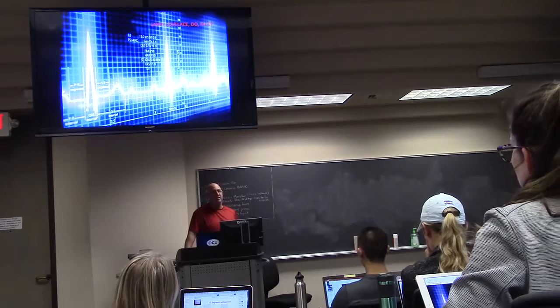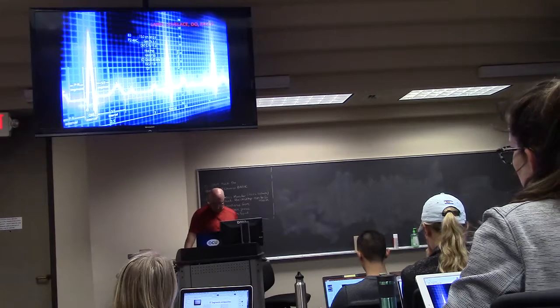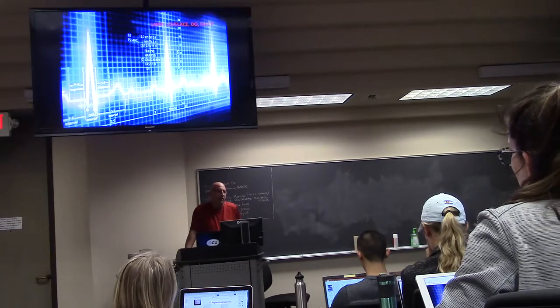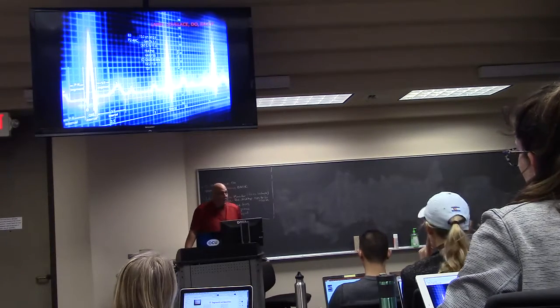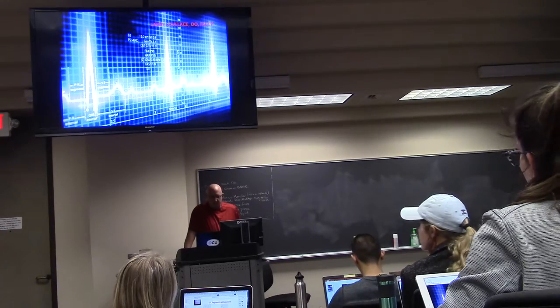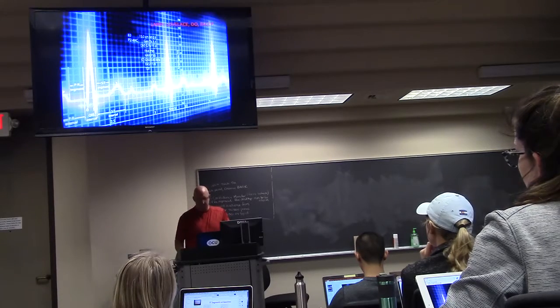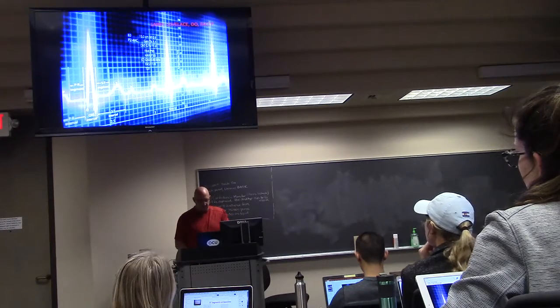So this is a lecture on the deadly EKGs. I know you guys have already had EKGs. Usually I get to teach EKGs, and I've got my own unique way of teaching them. Unfortunately, I didn't get to do that with you guys, so hopefully you know your EKGs really well. This is not a lecture for beginners. This is a lecture for people that pretty much know what's going on with EKGs.